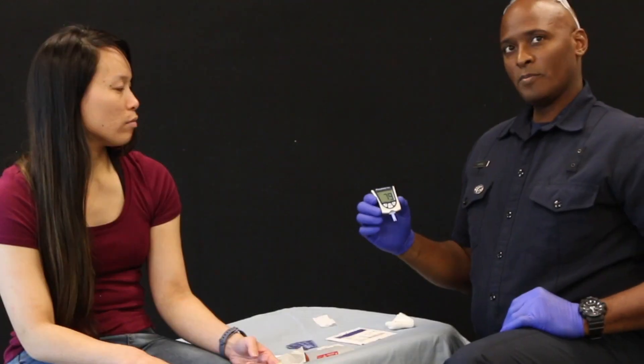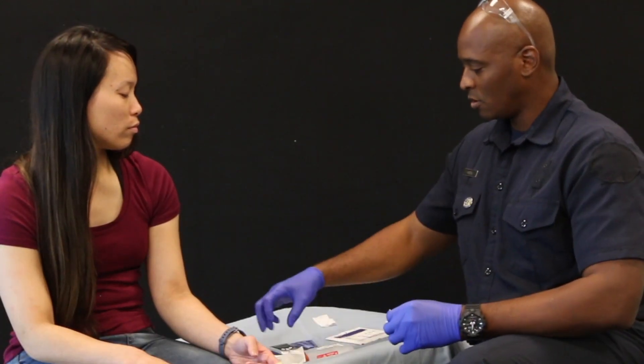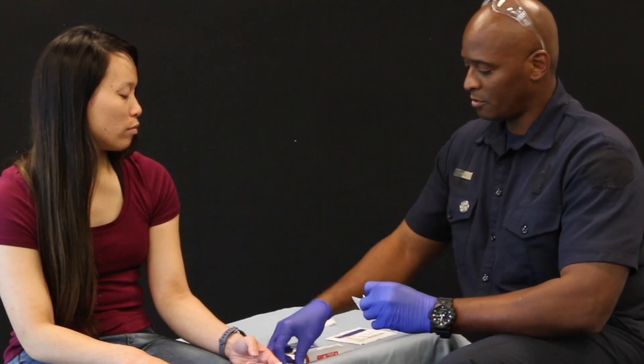Once I'm done with my skill, I will dispose of my materials. Now you know how to assess a blood glucose level during a diabetic emergency.